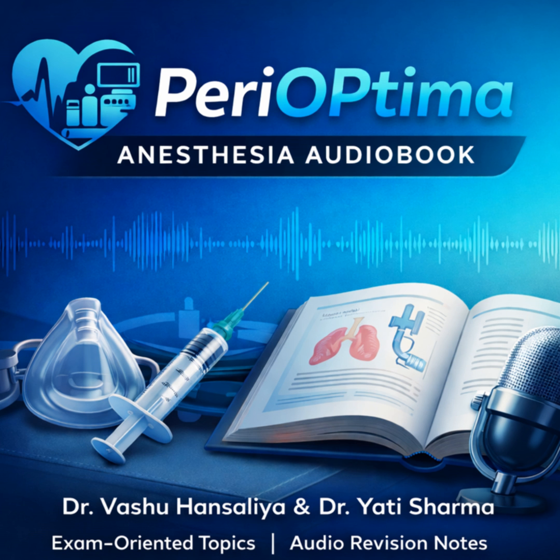Correct. Now, I want you to visualize the waveform. It has 3 peaks, P1, P2, P3. P1 is the percussion wave. That's the arterial pulsation. P2 is a tidal wave related to brain compliance. And P3 is the dicrotic wave. Here is the exam tip that separates the pass from the honors.